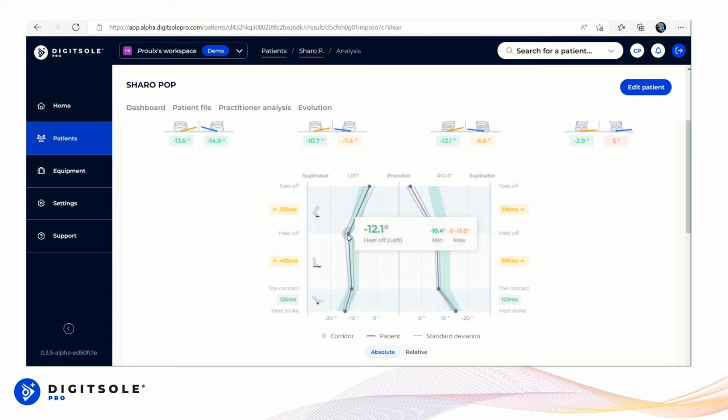It may not break that 0 degree mark, but oftentimes it will once you get into the toe off position. So we see that the heel actually moves into a relatively normal position as we transition into that first and second ray. If we look over here to the right, we do get a much larger translation, and it goes into a very positive angle, meaning that the heel is now everting past the neutral position into a positive angle. So it's actually positioned much more laterally, or in eversion, in terms of that position.